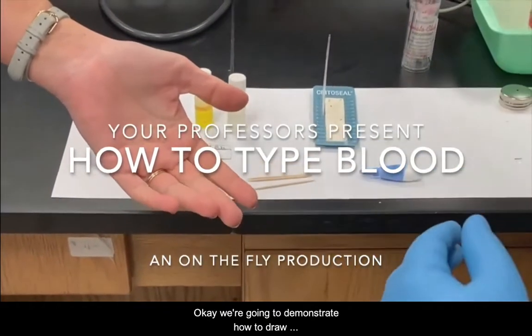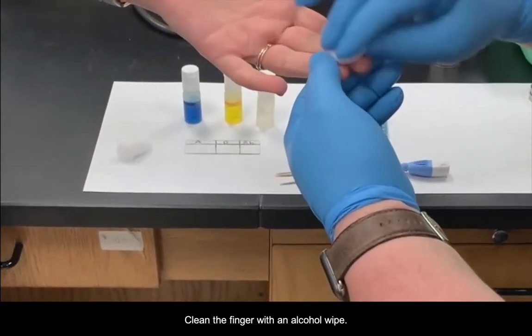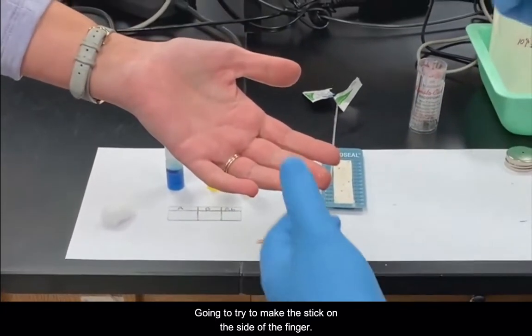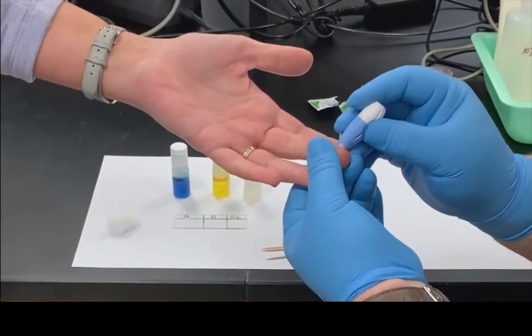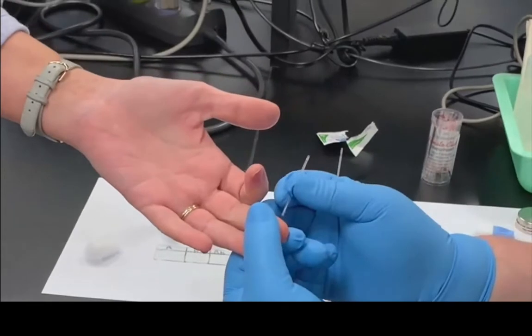We're going to demonstrate how to draw blood for a blood type test. First, we're going to clean the finger with an alcohol wipe. We have a spring-loaded lancet, and we're going to try to make the stick on the side of the finger. Then we're going to collect the blood in a pipette tube.